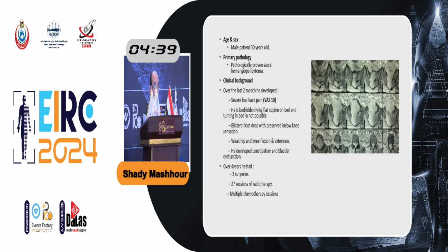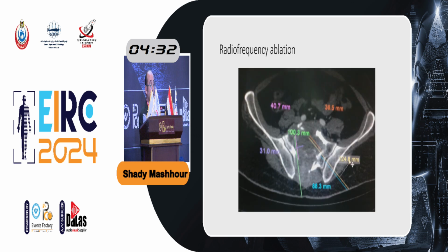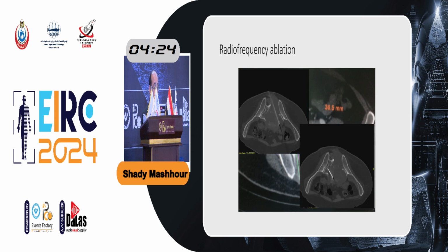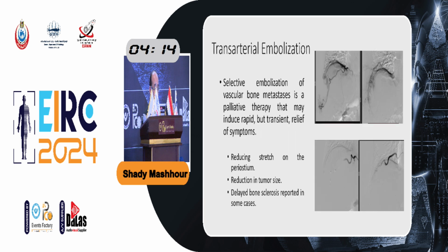This is a patient who had a metastatic lesion to the sacrum, very vascular. First, we did some embolization to reduce the vascularity and reduce the power. We planned, very important to plan. This is an elective case. You can plan and discuss. And then we went on our planned sites and tried to ablate the bone-tumor interface. This is the after. We can find that the areas along the bone-tumor interface are ablated, and he had quite adequate pain control.